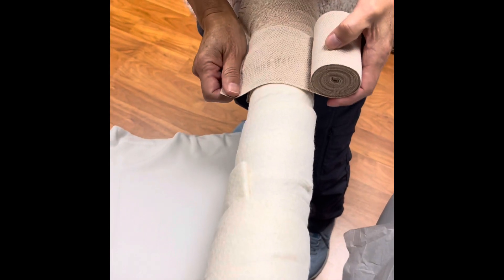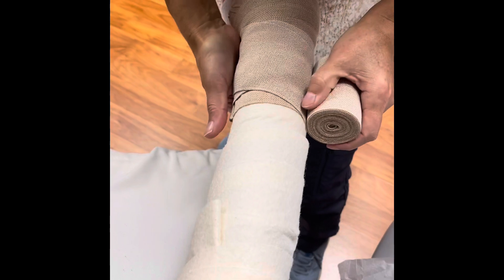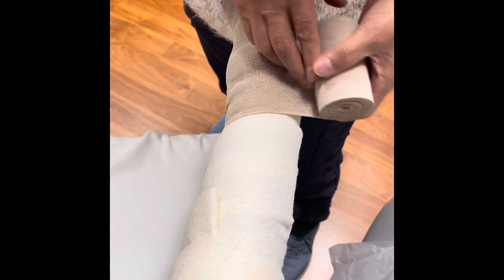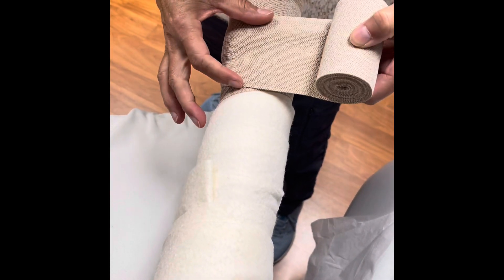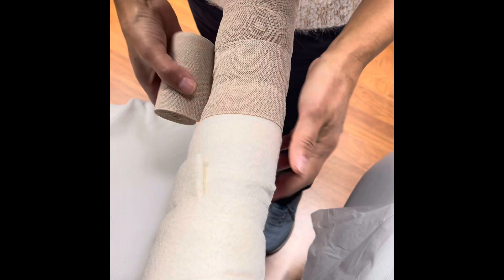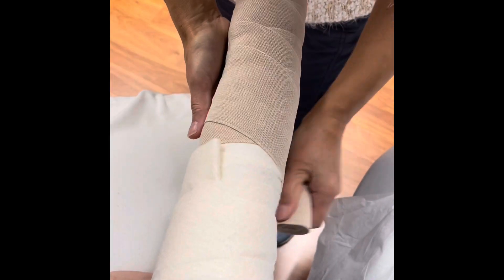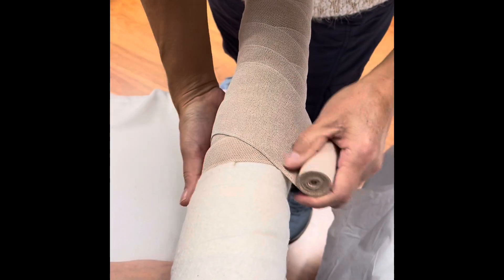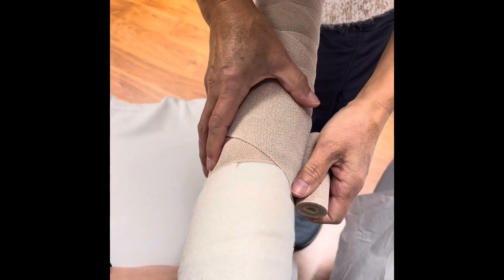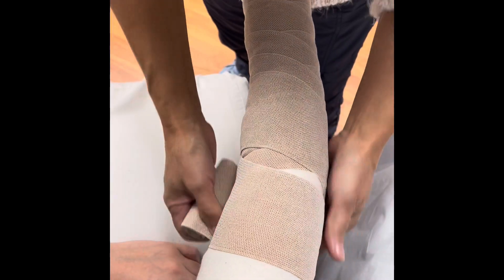Close your hand and hold it there. We start down by the wrist with the second bandage and again do the spiker pattern — go up at an angle and come back halfway. Halfway meaning half of the width of the bandage. Some bandages now give you a line as a guide. When we get to the elbow, I have her bend slightly, come up above it and come back at an angle.